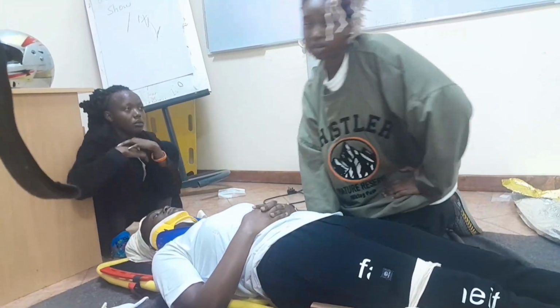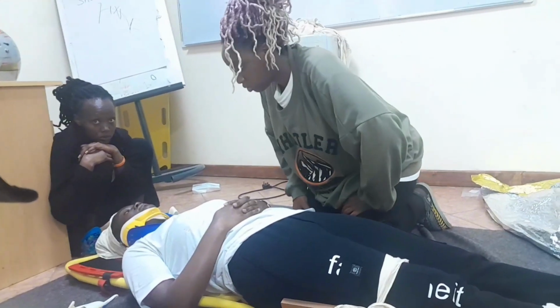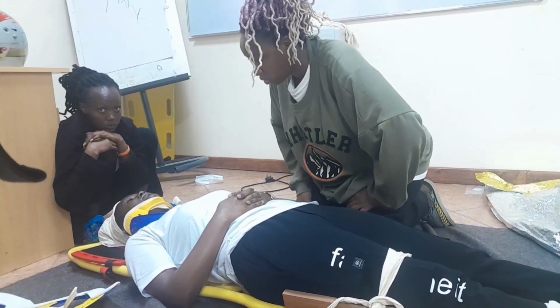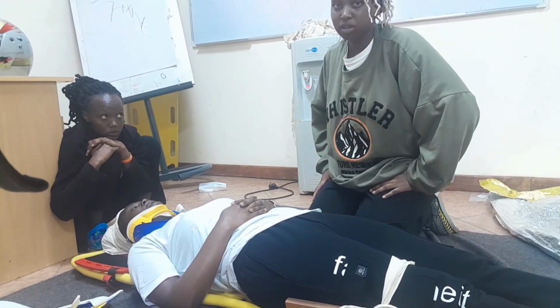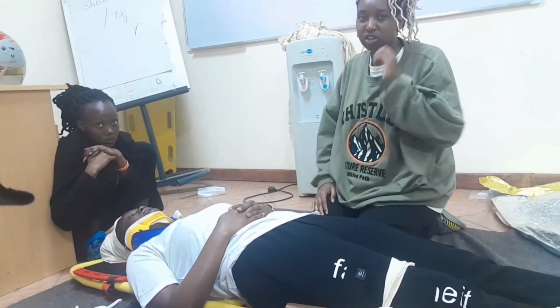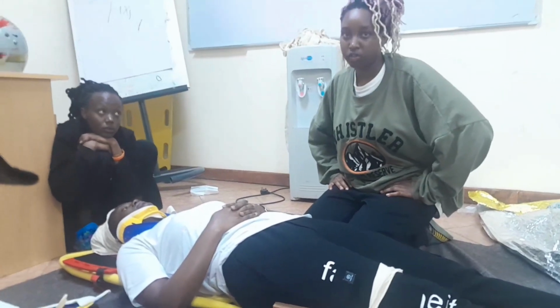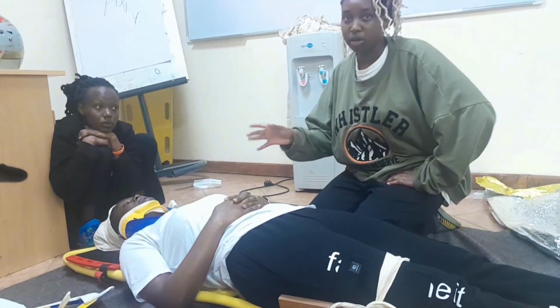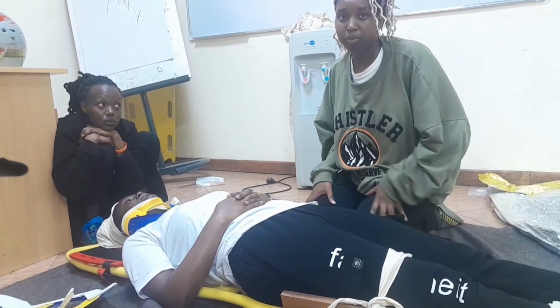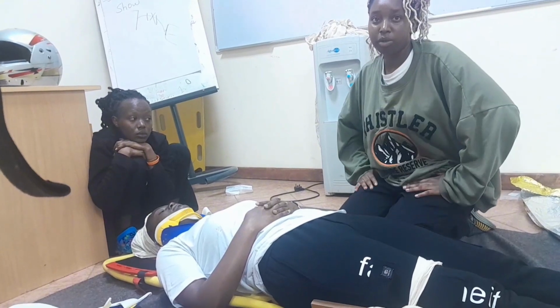And I'd like to assess her RR. The RR on a full minute is 26. It's remained the same from the last time. And her SpO2 now, since I'm in the vehicle? SpO2 is at 95. I'll continue the same level of oxygen, it was 12 liters per minute. I'll continue that, and I'd like to check her BP.